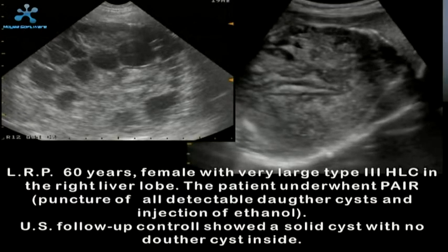This is a very large multi-loculated cyst, treated by injection of ethanol and aspiration. All the visible daughter cysts, actually there was a shrinkage at the first follow-up. In the first 2 years, some daughter cysts reappeared inside the cyst during the follow-up, and have been treated again 2 more times, and the patient is now still in follow-up.